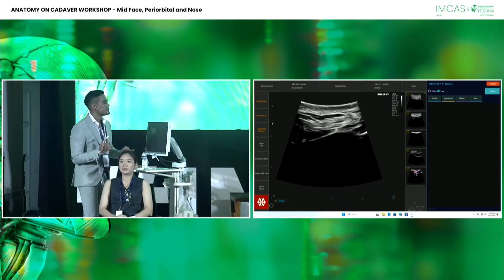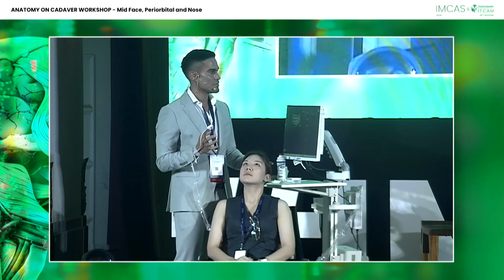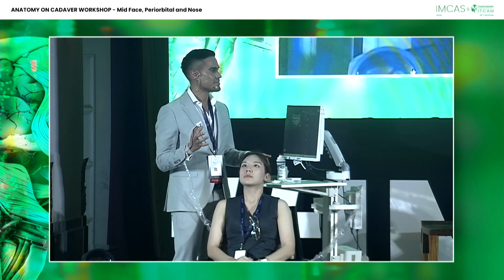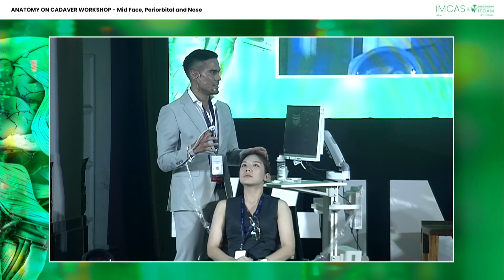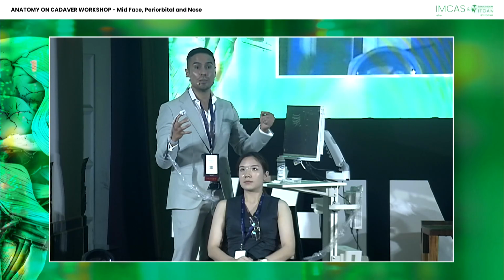So, Maurizio, just to let the audience understand, because only 2 of them actually use ultrasound, as we voted for that before, this is the only ultrasound device with which you can inject and see the ultrasound picture manually. You don't need another assistant, right? Exactly. So you're having visualization right away while you are injecting without changing your workflow, without actually taking more time to do your treatment, because you're having it right on your finger and it's not heavy. It doesn't overheat. It's just 15 grams.